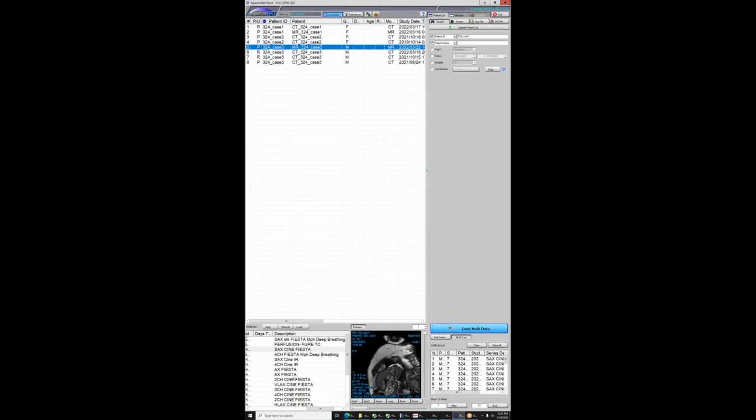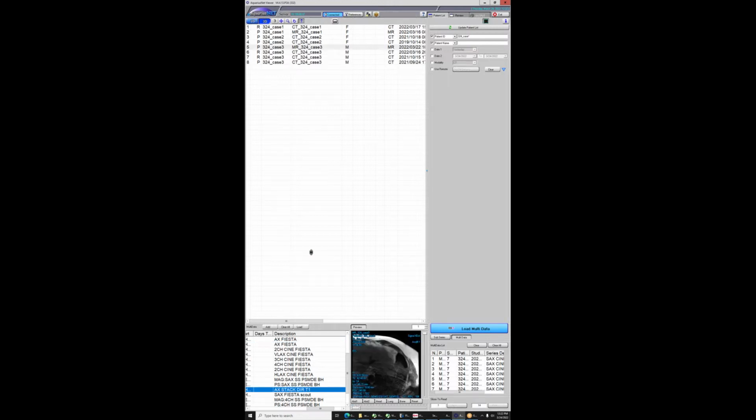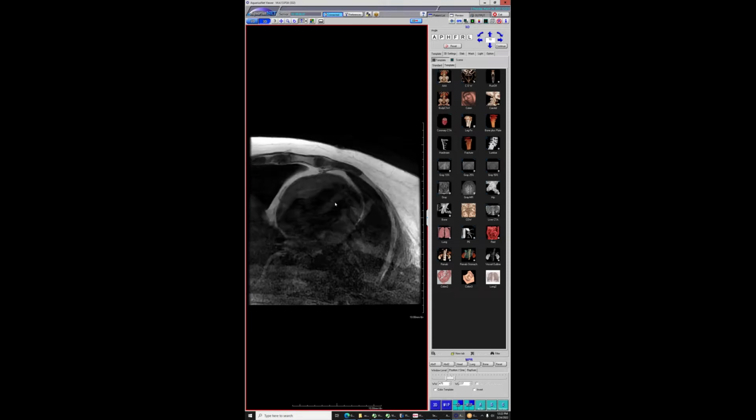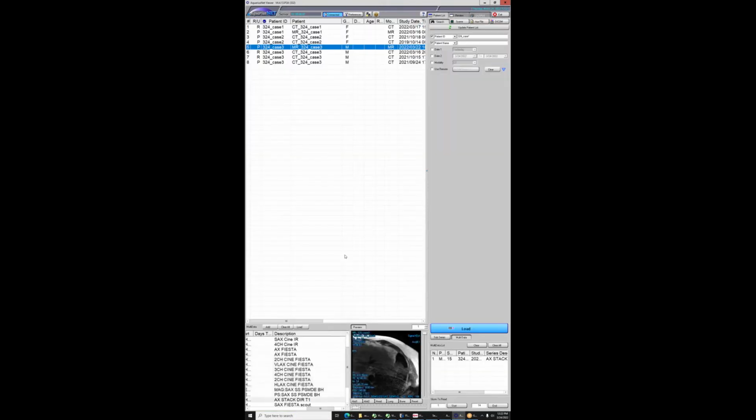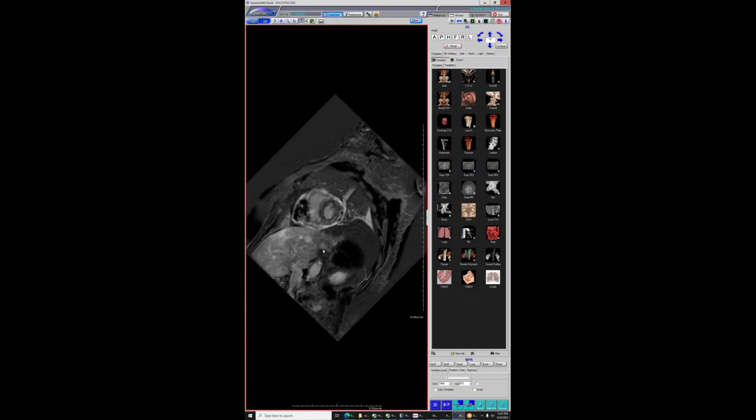And the read was more just saying there was a tumor, didn't really give a differential. Here's, see if I can get this to open. And this tumor had a lot of necrosis in it. Can't find the T2. I'm not going to waste too much time, but on the T2 weighted imaging, there was a lot of necrosis in this tumor, and they were going to biopsy it.